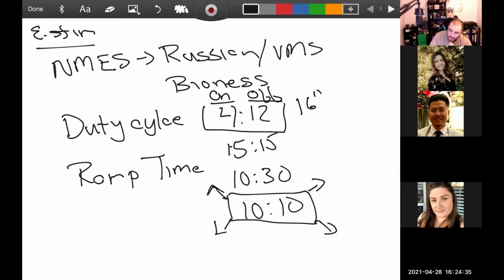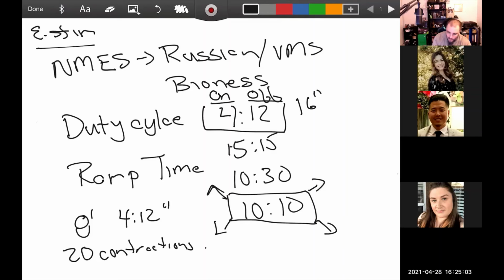So how do you know how long you're going to do Russian for? Well, one of two things is going to come from your CI or your PT. They're either going to say, do 8 minutes of E-stim at 4:12 ratio. Or they'll say, and this is where it gets to be a pain in the butt, do 20 contractions at 4:12 ratio. Now you've got to do math. And that kind of sucks.